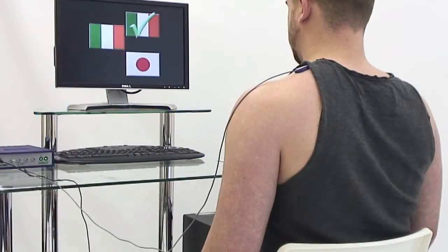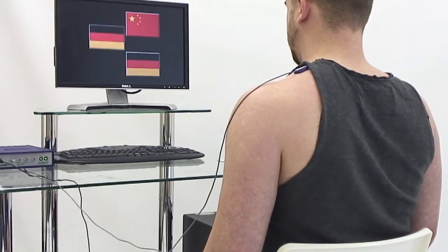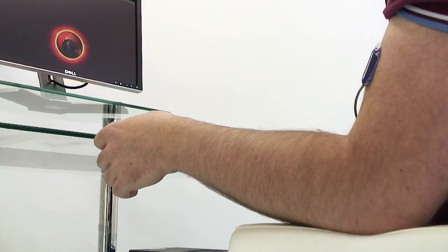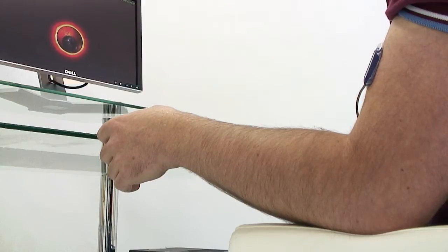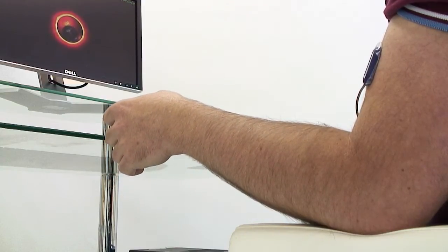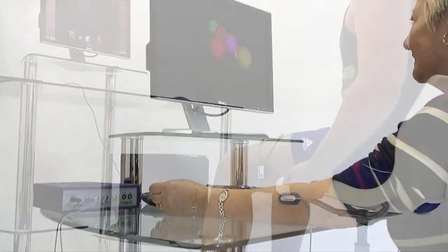Even in the acute phase of stroke recovery, exercise can begin as soon as there is the smallest flicker of voluntary muscle control returning, by using innovative MYOX sensors for surface EMG. Current research considers this early emphasis on exercise to be essential for good recovery. Even when there is no visible joint movement, the visual stimulus from the activity provides immediate biofeedback and helps the patient know when they are actually activating the muscle.